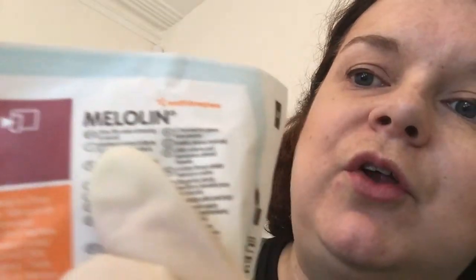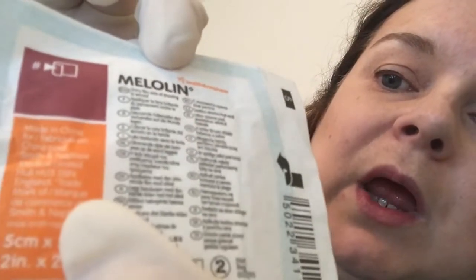This brand is lovely because on the front of it there is a lot of writing. One of them says ENG — I'm hoping it means English and not just England, because Scottish people will get very upset. But it says 'shiny film side of dressing to wound.' And if English isn't your first language and you get stressed in the exam, that's all the same thing written in different languages. So that means I know when I open it, the shiny side of this film needs to go to the patient.